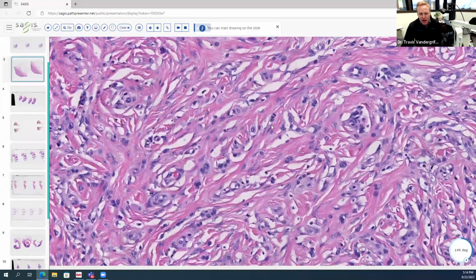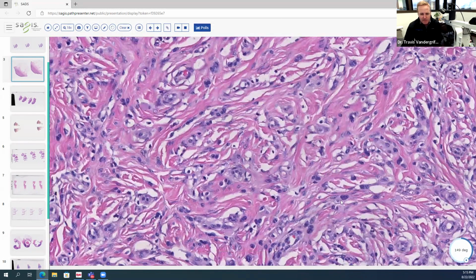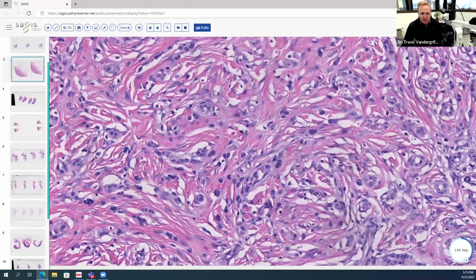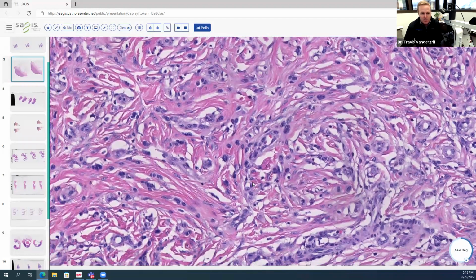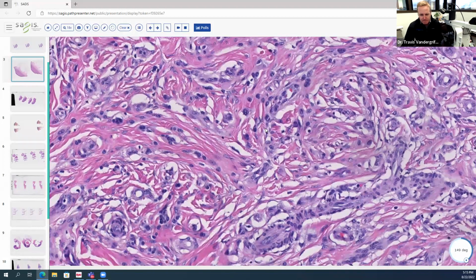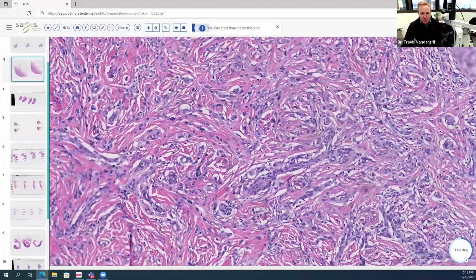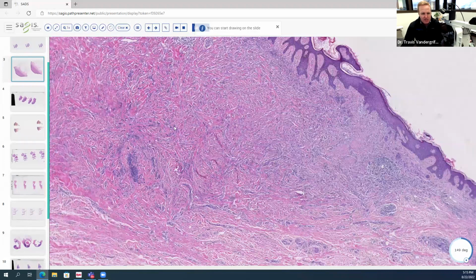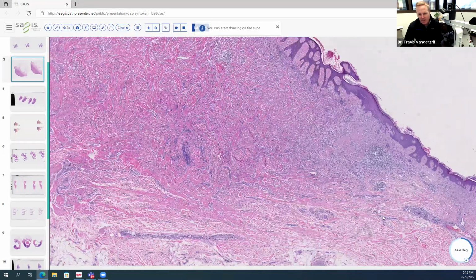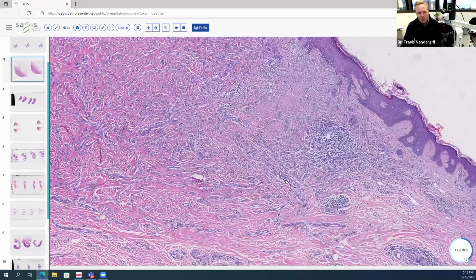The melanocytes here have a round nucleus and abundant cytoplasm, which is a morphology we call spitzoid. A spitzoid melanocyte is one that has abundant eosinophilic cytoplasm and a large nucleus. But we also have this background of blood vessel proliferation. So there are two processes going on simultaneously and merging together. This is a variant of a Spitz nevus that's called angiomatoid.